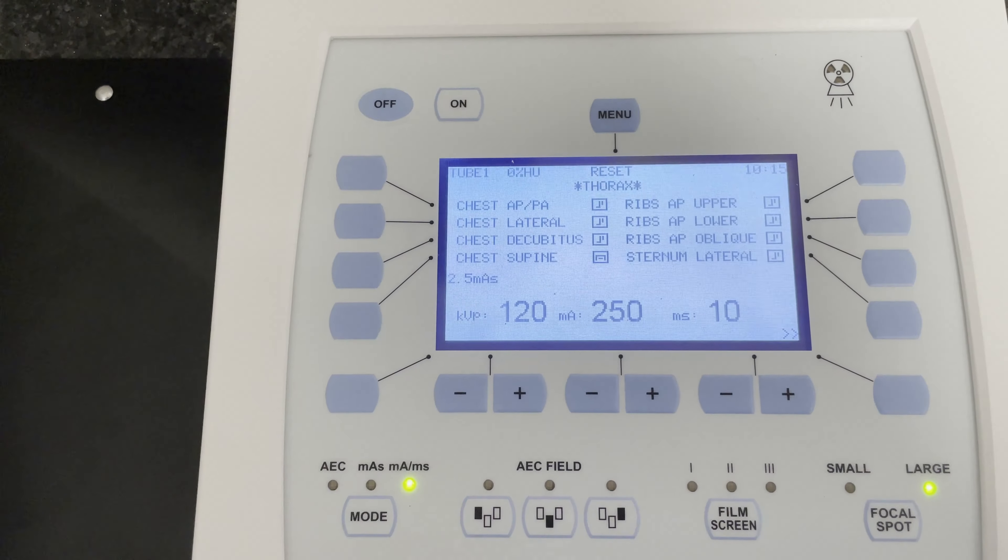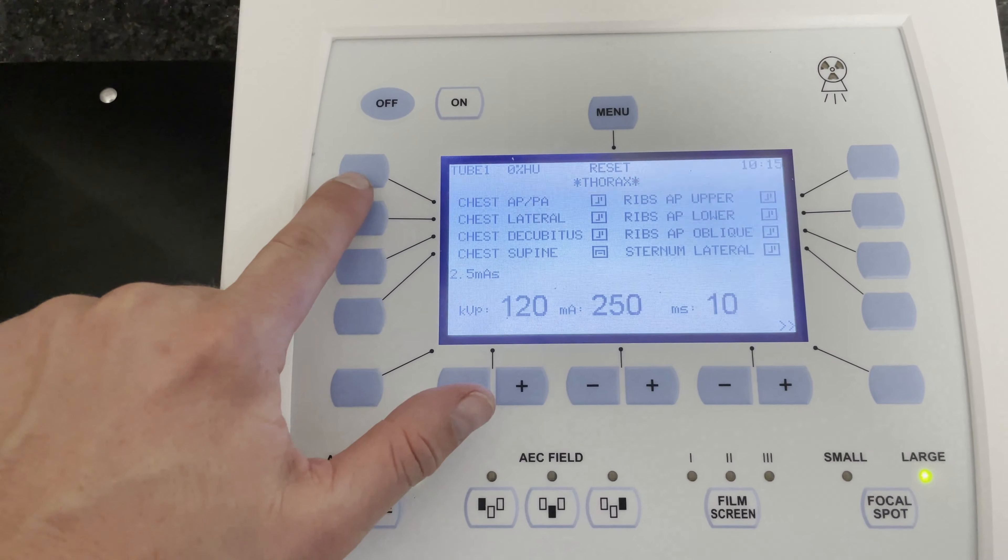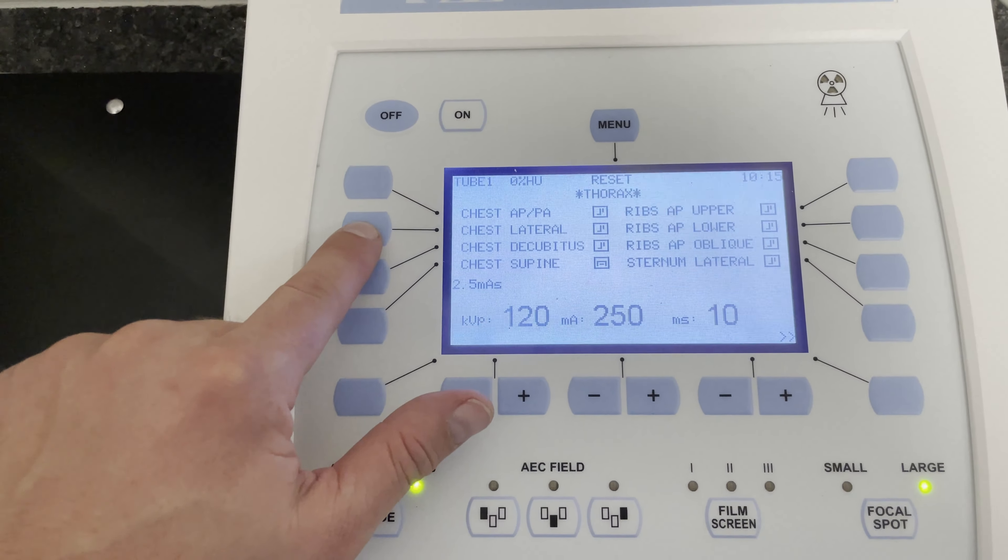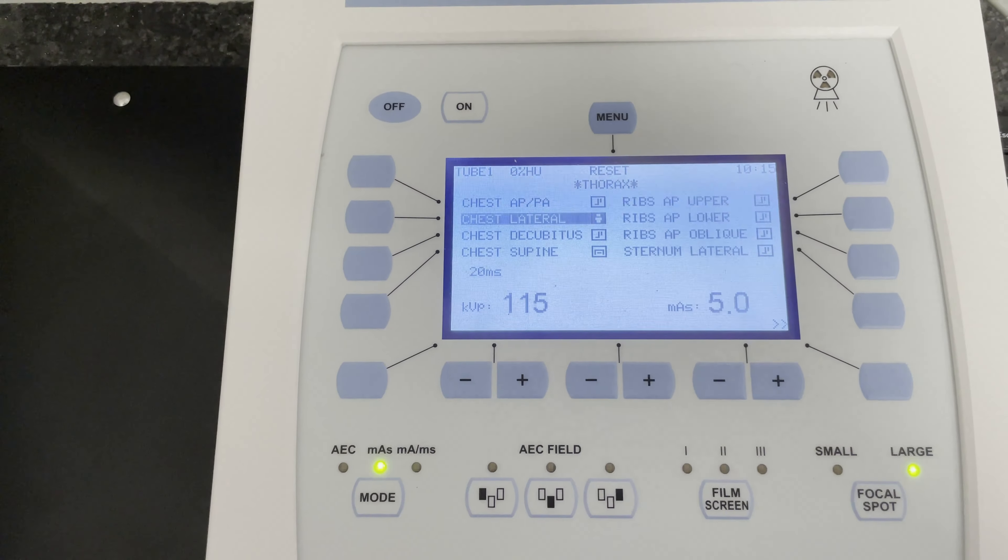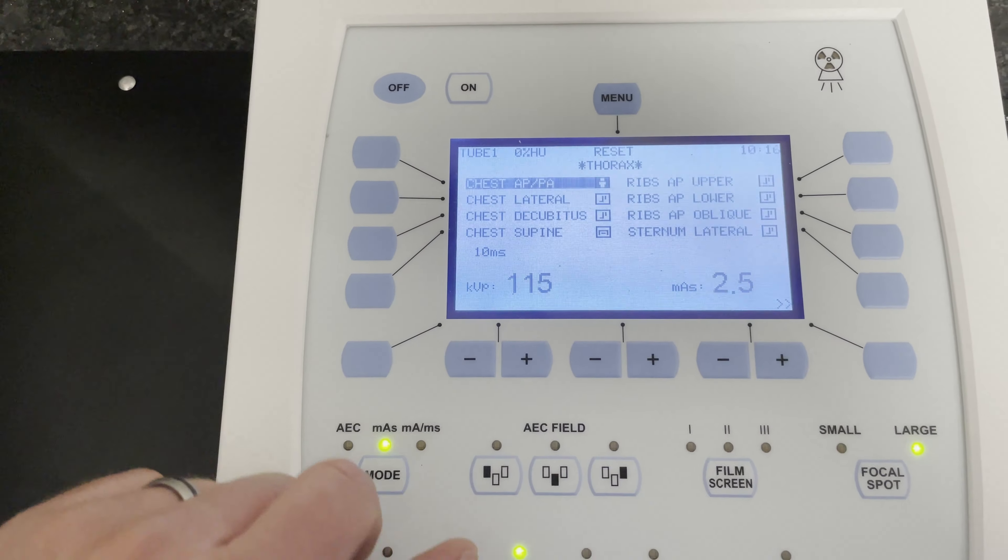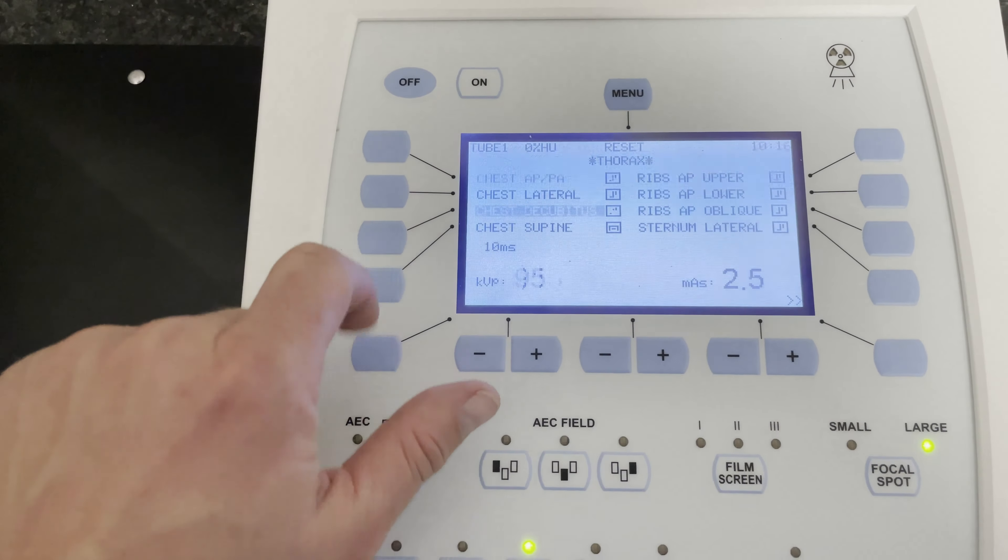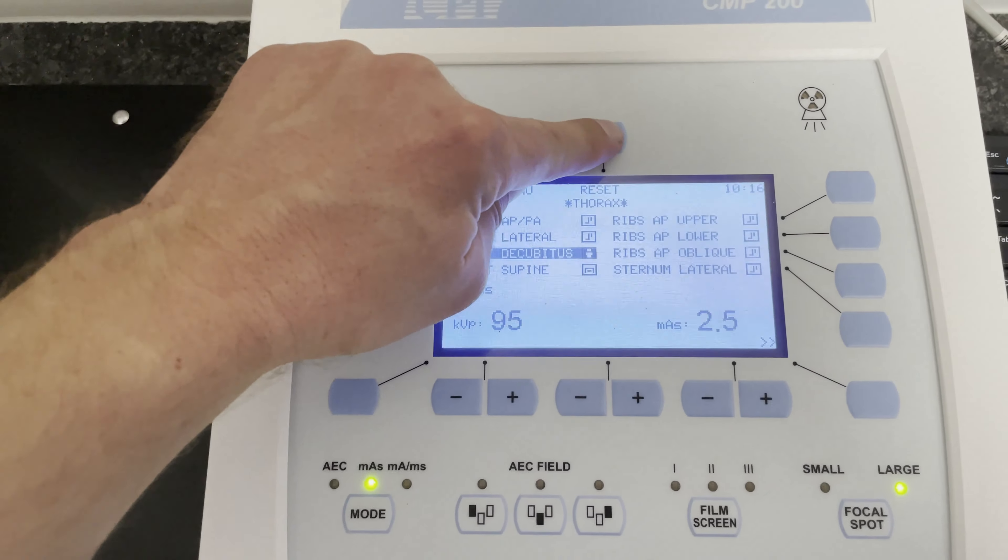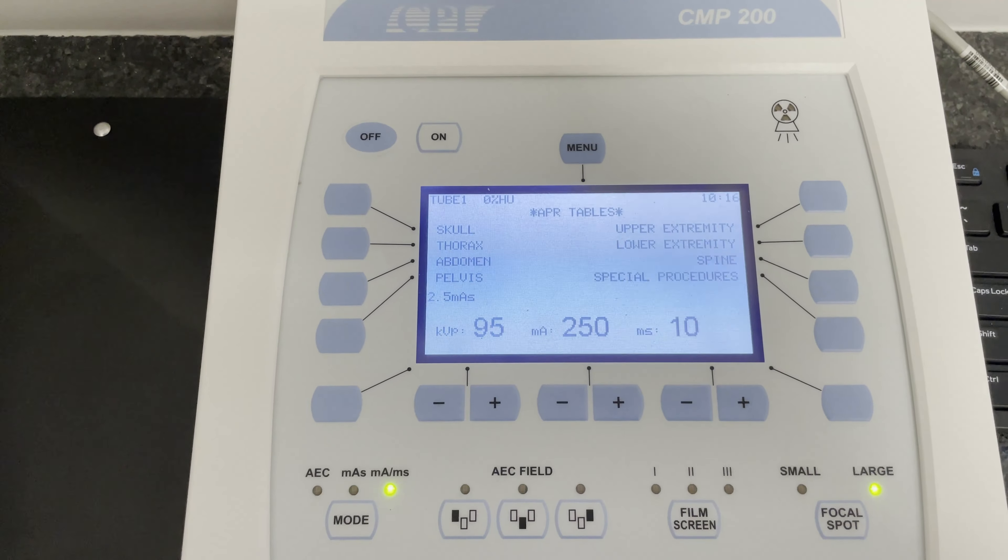Now if you were already in that region, you could choose whatever section that you'd like. And again, to go back, you hit the menu button.